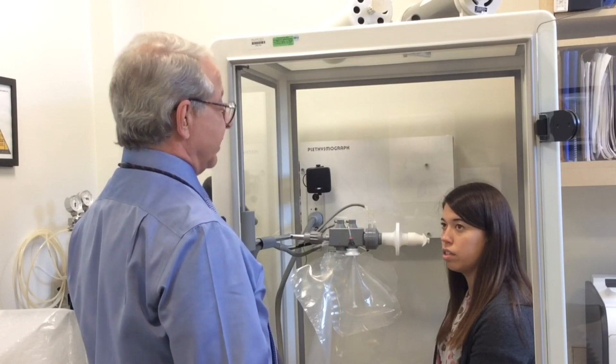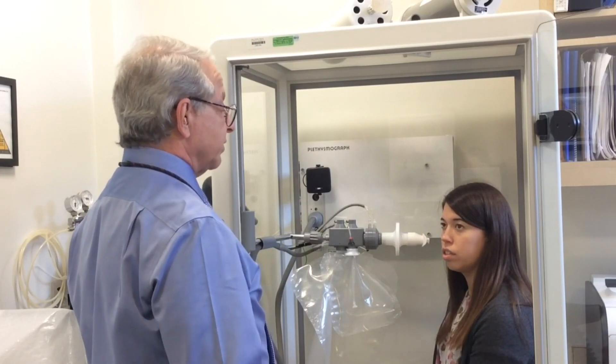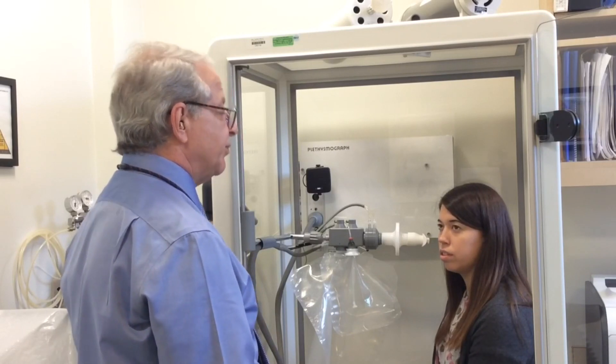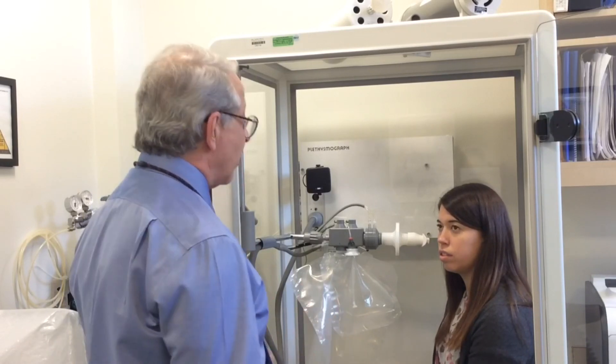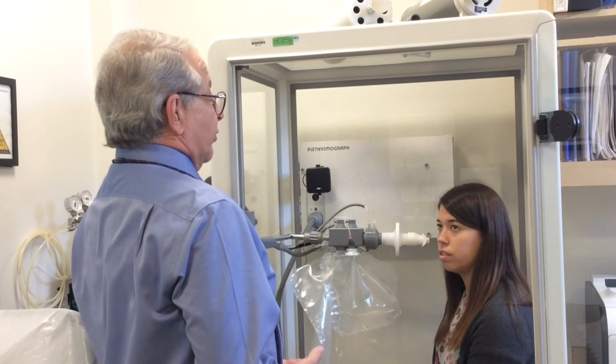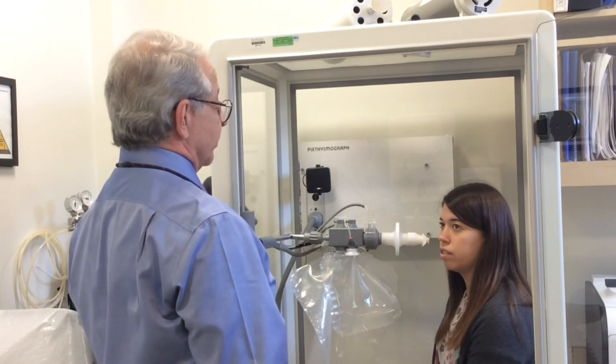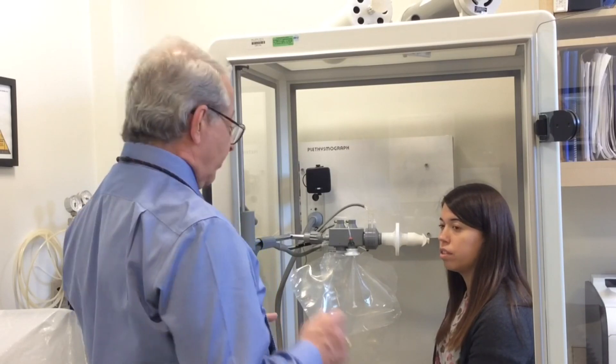And then I'll say to you during the out breath to blow it all out. What I want you to do is fully exhale, squeeze all the air out, and then I'll say to you take a deep breath in, fill up maximally all the way. You're going to hold your breath for 10 seconds. I'll count off the time, and then what you're going to do is, when I tell you to, blow it all out.